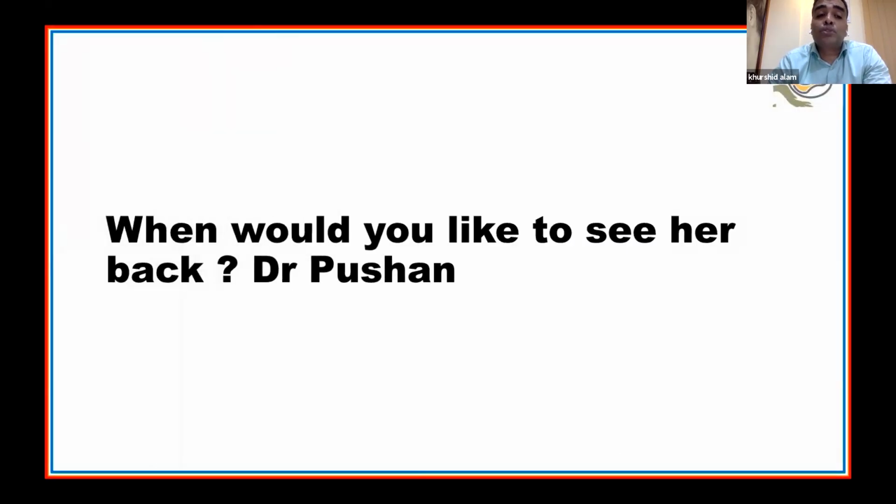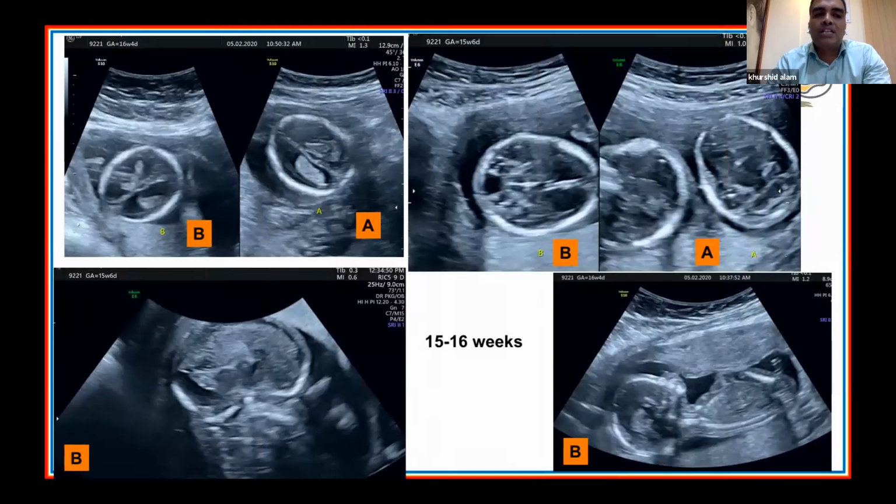Now, to Dr. Pushan Kundu sir, when would you like to see her back? We have done a first trimester scan, we have raised a red flag. Now, when do you want us to call this patient back, sir? I wouldn't wait till the normal anatomy scan. We'll probably see her back in 3-4 weeks, around 15-16 weeks. Then we should be able to evaluate the posterior fossa much more clearly, and we can appreciate the different structures better at that stage.